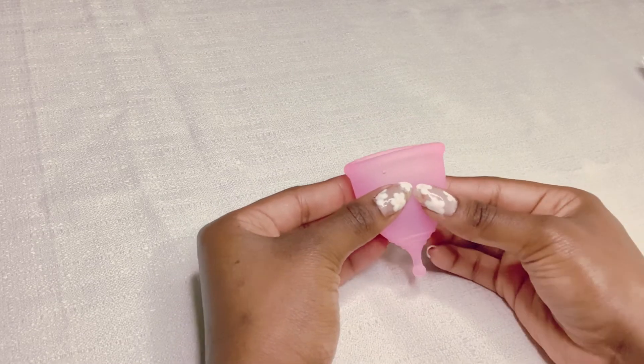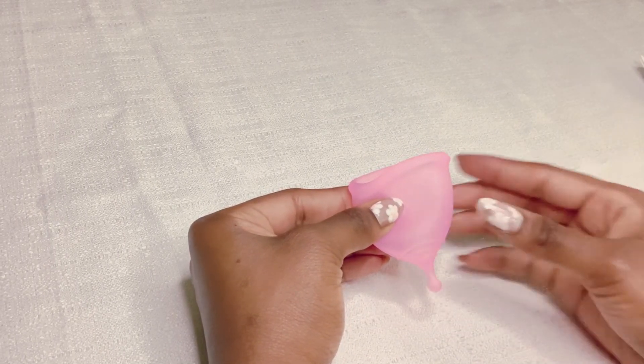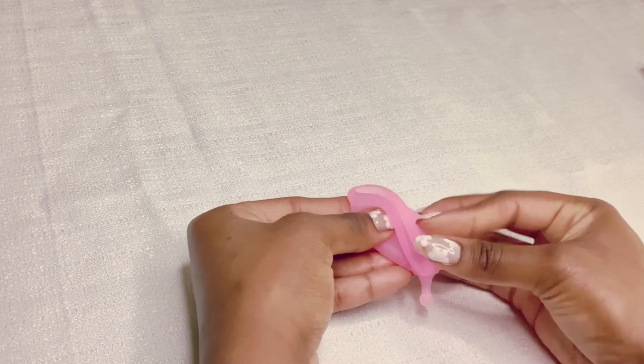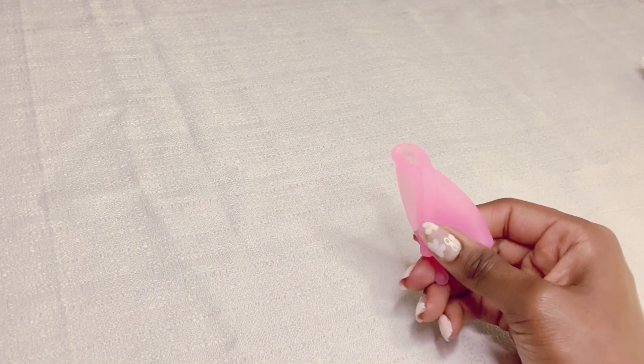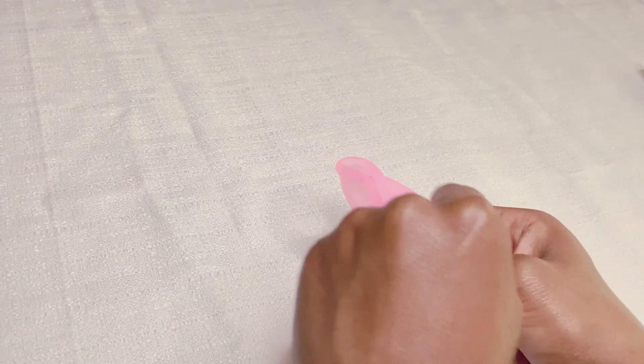Next, we have the triangle fold. So if the punch down fold doesn't create a small enough point of insertion, then we recommend using the triangle fold. To do the triangle fold, you squeeze the cup to make it flat, then take one corner and bring it all the way down to the base of the cup. Then to pop this open after you insert it, you push on the created fold and it should pop open.